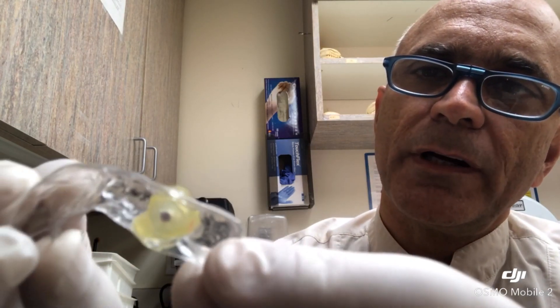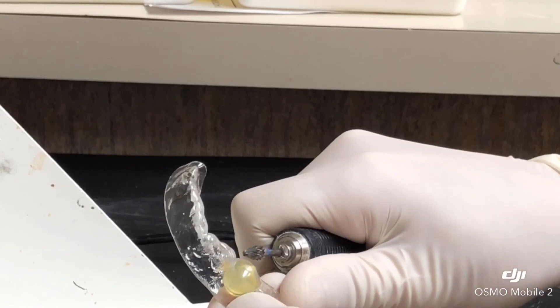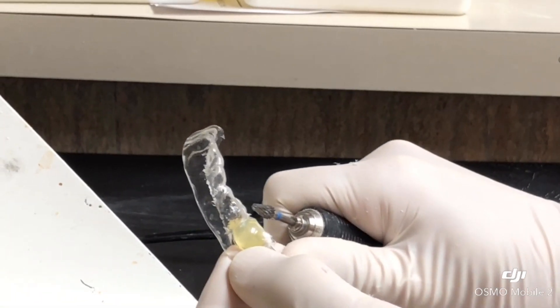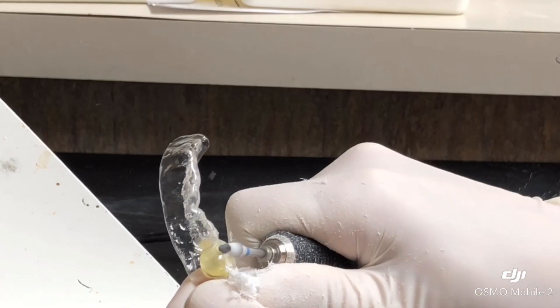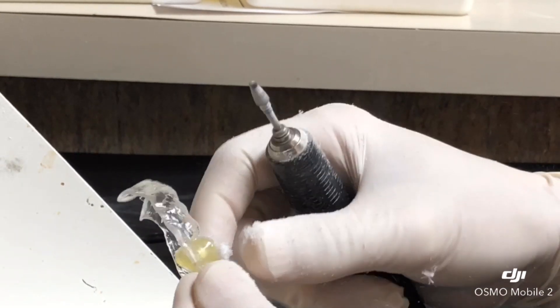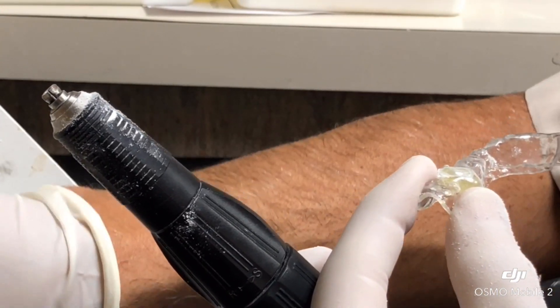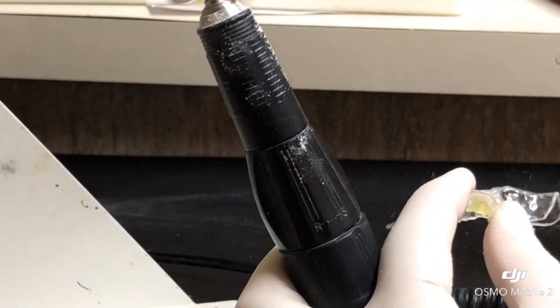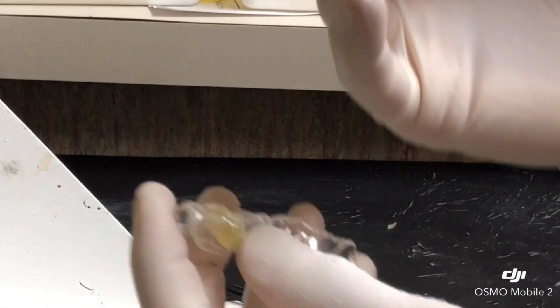We're going to remove the gutta percha and create a hole that is exactly two millimeters wide with the same zirconia burr that we're going to use. We're going to remove the gutta percha and create a flat surface. Let's take a narrow burr and just melt it out.